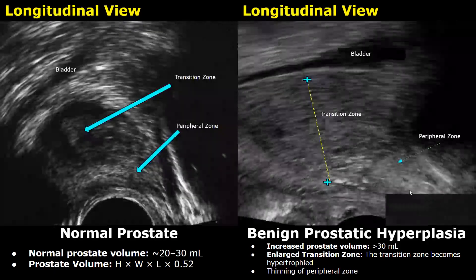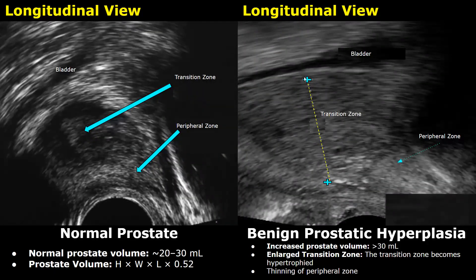This image shows BPH in the longitudinal plane. You can see an enlargement of the hypoechoic transition zone — this entire area is the transition zone of the prostate, and the more echogenic peripheral zone is down here. The prostate gland is enlarged with an increase in size of the transition zone and thinning of the peripheral zone.